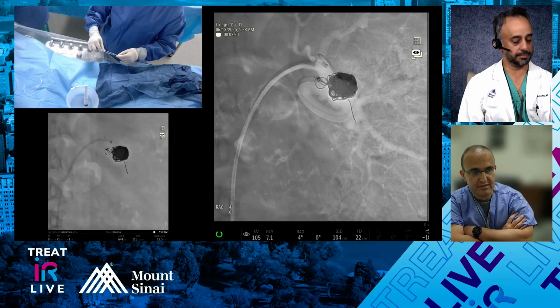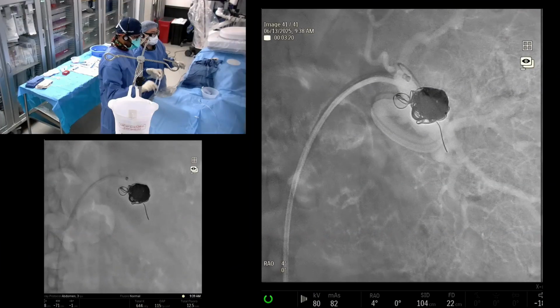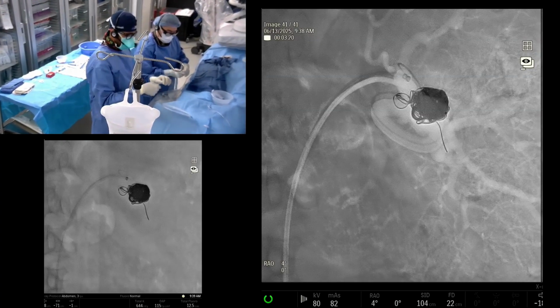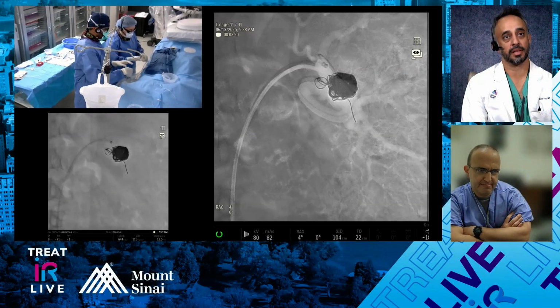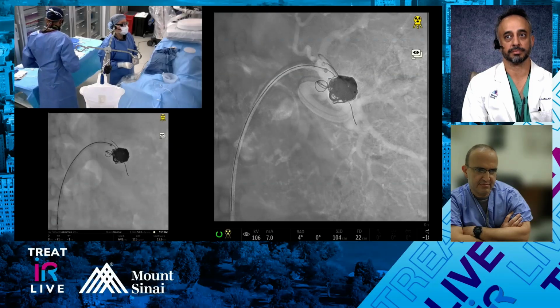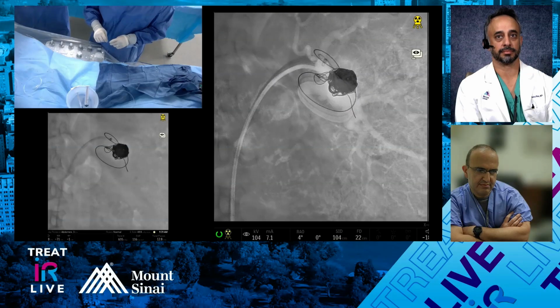So just to let you guys know, I'm at the origin of this splenic artery aneurysm, and really just at the proximal inflow vessel. So I'm going to put a nice little coil in the inflow vessel and call it a day. We'll probably be deploying our last or second to last coil. What size are you using for the inflow? So we measured on the CT, it measured about 7.5 millimeters. And here it is coming. The tip is right at the inflow right here. So we pulled an 8.